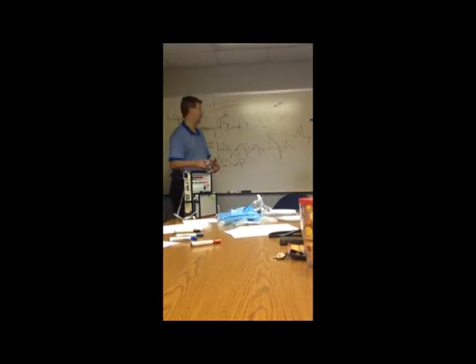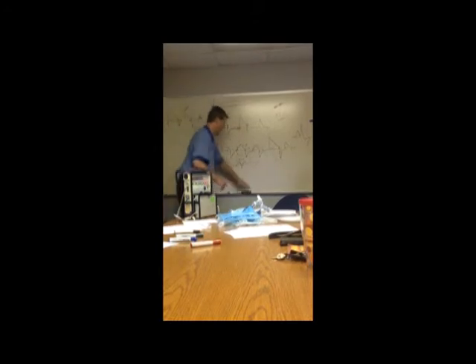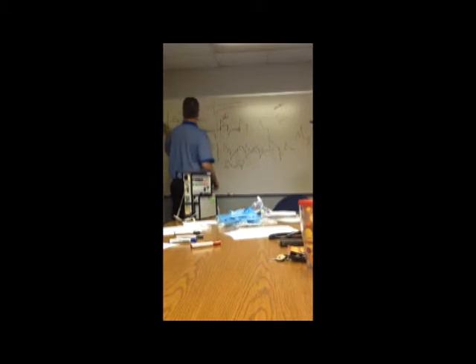So then there's not much else. There's a few other things you can do if they're not settled down, and we'll talk about that in a second. But that's the biggest and the most helpful thing you can do, is get them out of SIMV if they're in that. If they're in that and happy, bring them on. If they're not happy, switch to this. Don't do that. That'll be laughed at.